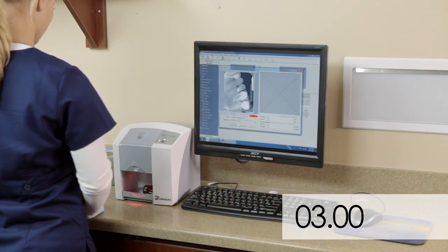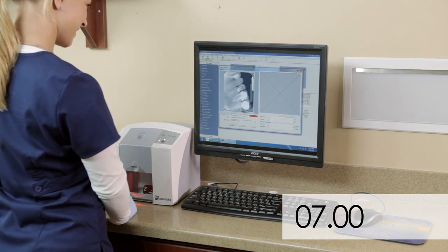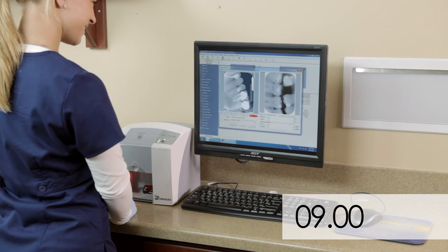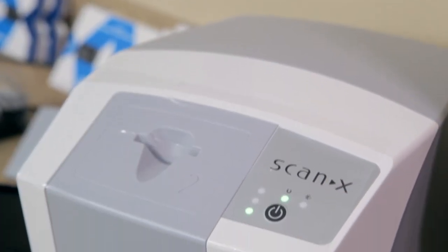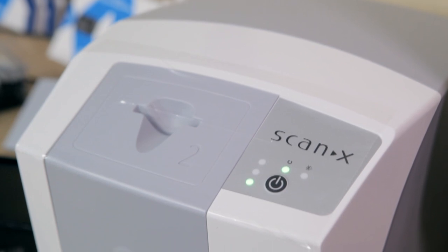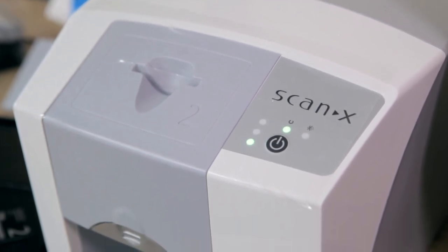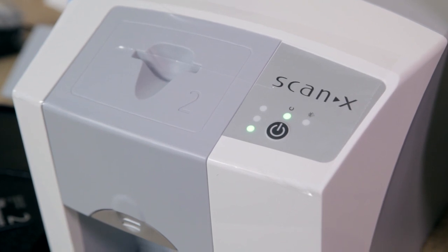Press the sensor down until the unit grasps it and moves the sensor on its own. Only 9 seconds after inserting the sensor into the unit, your image is ready. Even if you use hard sensors, Swift flexible phosphor sensors will be a good alternative since they are comfortable for patients with small mouths, difficulty in opening wide, or gag reflexes. Swift. More comfortable for patients. Easy for your team. 100% of the radiographs you want.